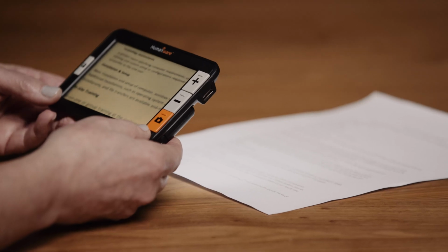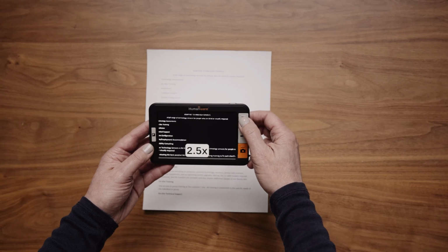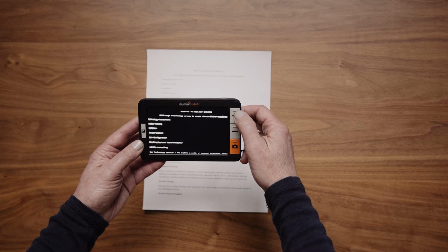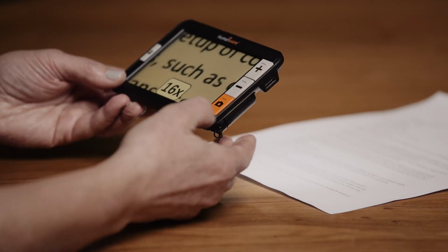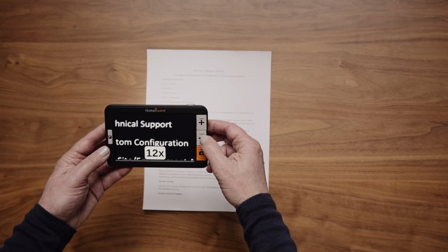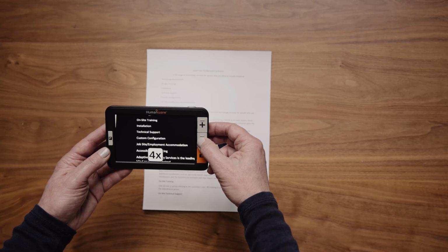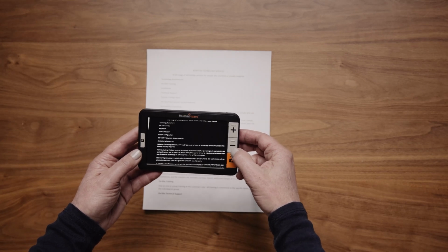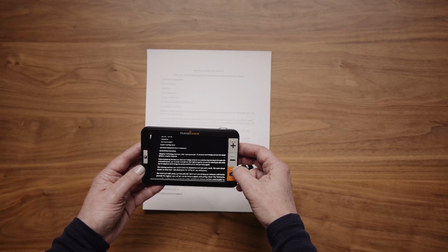Adjust magnification. 1. To increase magnification one step at a time, tap Zoom In plus, top right-hand button. To increase the magnification quickly, press and hold the Zoom In plus button. 2. To decrease magnification one step at a time, tap Zoom Out minus, middle right-hand button. To decrease the magnification quickly, press and hold the Zoom Out minus button. Note, Explore 5 has a magnification range between 2x and 22x.